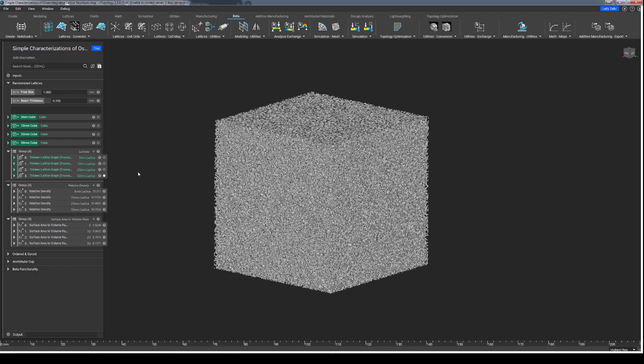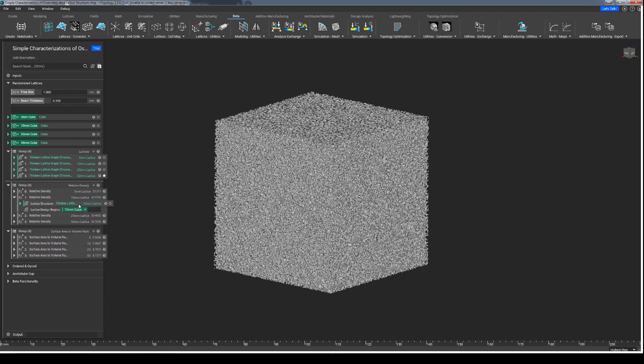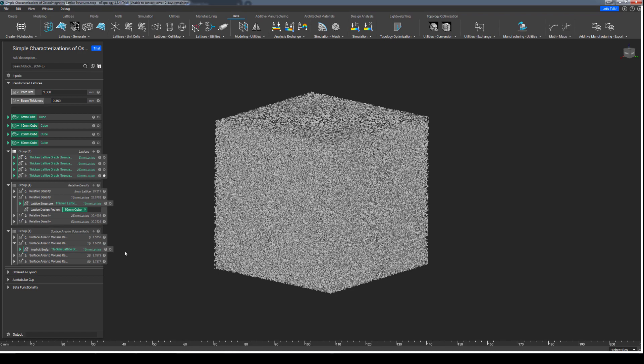Within the osseo-integrative structures toolkit, I have provided these two blocks ready for immediate use, and leveraging them is actually quite simple. For the relative density, we are simply looking to drop in the lattice we wish to measure and the reference geometry to measure it against — in almost all cases, this will simply be the lattice design region we initially filled. For the surface area to volume ratio, all that's required is the lattice itself. Under the hood, the surface area and the volume of the lattice structure are being calculated separately, and the ratio between these two values is what is being displayed.